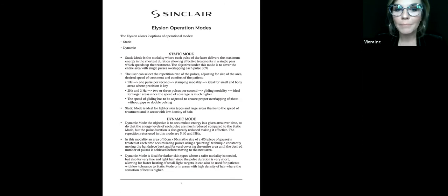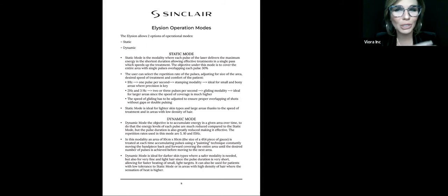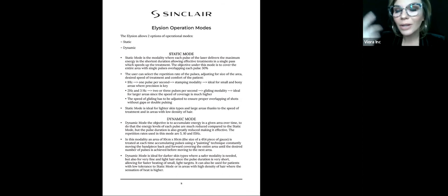And then additionally, for comfort, if you have a male who, I mean, we know males are not the best at their pain tolerance, and they're getting their full back done, it may be spicy, especially if they have really dark, really coarse, really dense hair. It can be spicy. So you can start out slowly on them. For their first couple treatments, you can do dynamic, where you're just slowly building up the heat, easy breezy, no pain at all. Then by the third time they come back, the hair has been reduced like crazy. It's no longer super dark and coarse and dense. You can move it to static. Now they're comfortable, and they're kind of used to getting treatments at this point. So they'll be more tolerant to it.